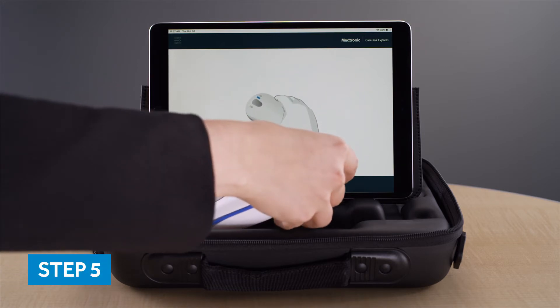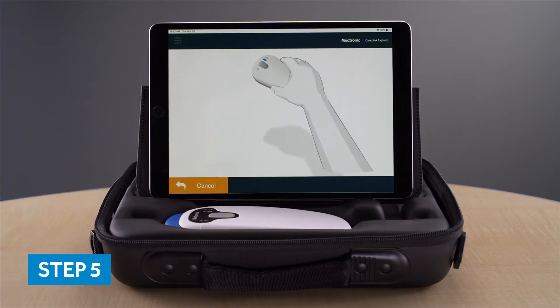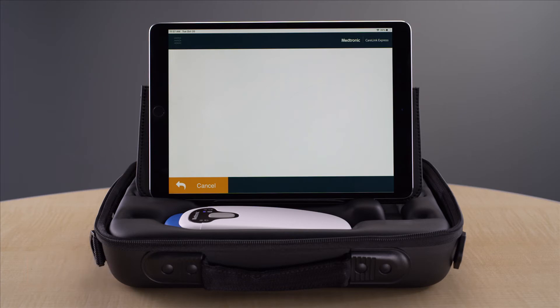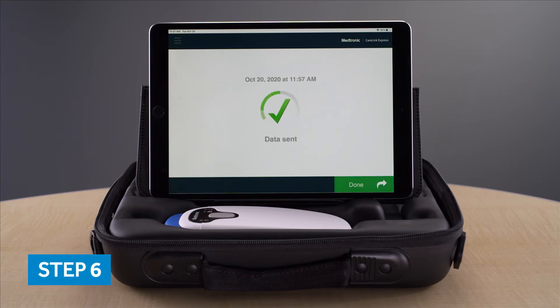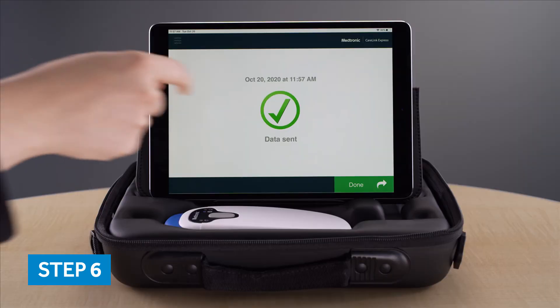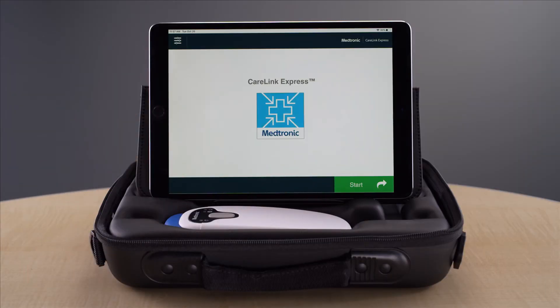A new screen will appear on the app indicating the device data is being sent over a secure network for review. Once all of the data has been sent, a green check mark will appear indicating the data was successfully sent. That's all there is to it.